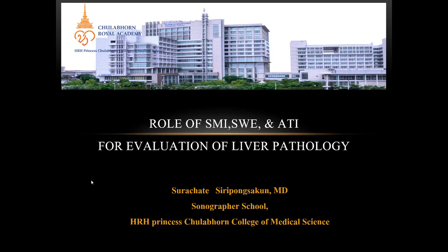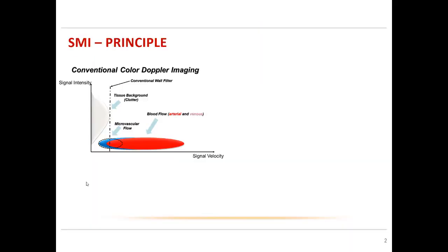So let's begin with the first modality of the machines, which is SMI. SMI stands for Superb Microvascular Imaging. This is the microvascular technique for ultrasound.